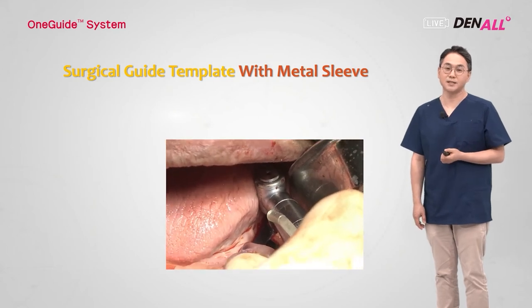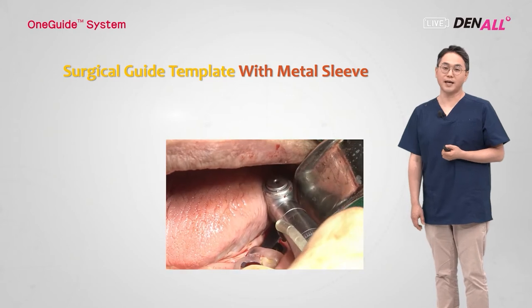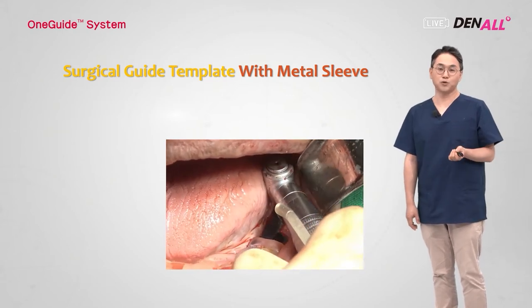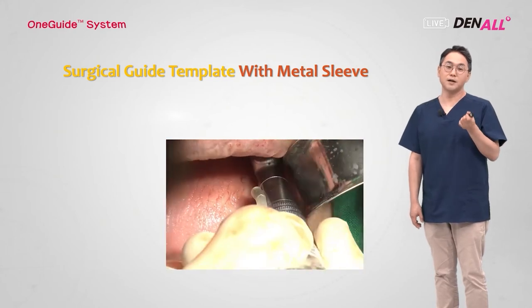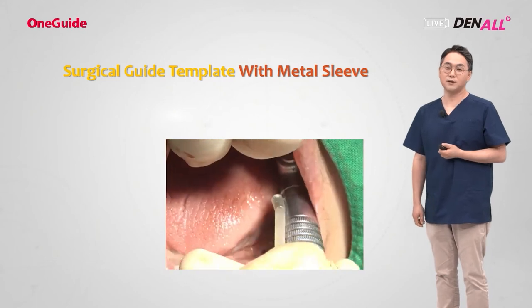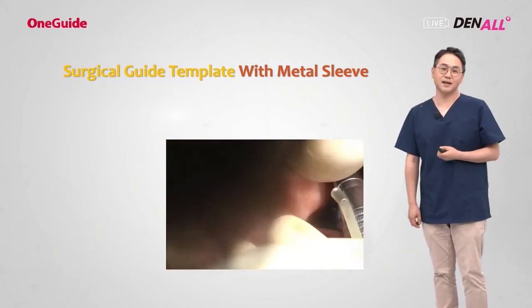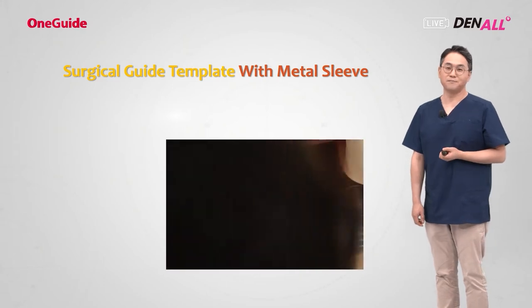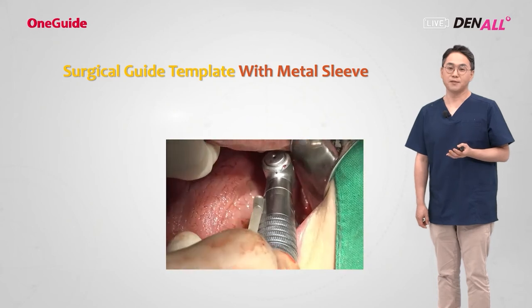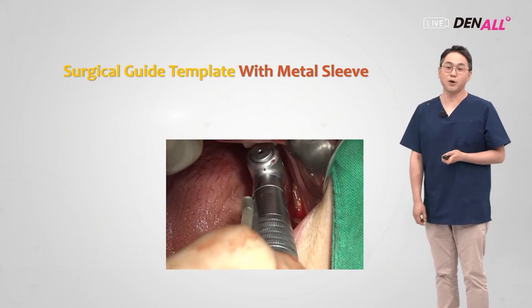During the drilling, she has to maintain the maximum opening. If she closes the mouth a little bit, the drill cannot go in. Even if it is inserted, it is difficult to remove. So I am forcing her to open the mouth to do this. Do you think this will be satisfactory for the patient and the dentist? I don't think so. The lateral access system can sometimes be very helpful.